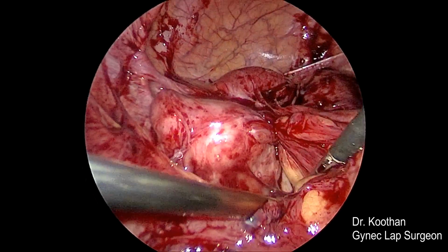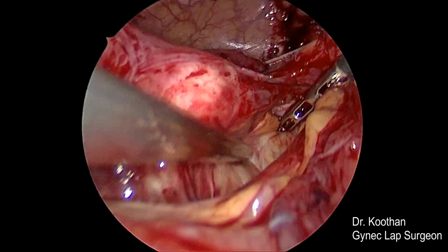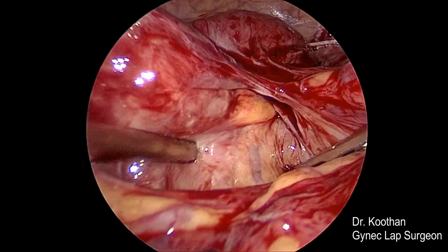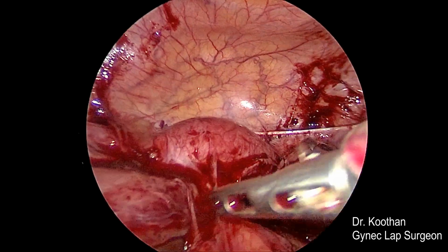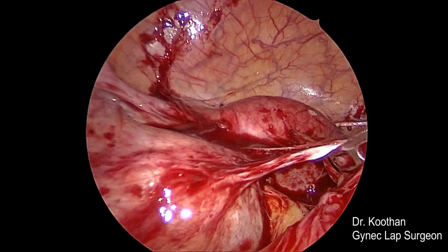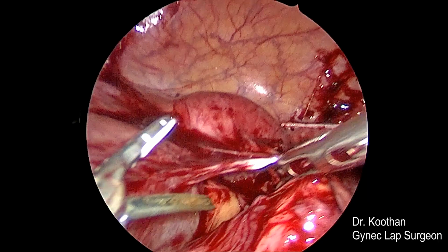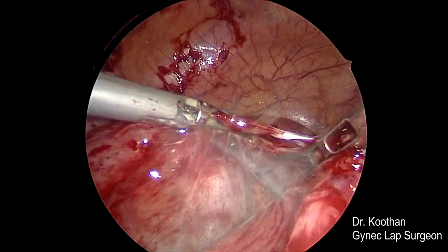So left side, what you can see is the huge Pyosalpinx, and the right side is the mesorectum, which is being dissected. We are using the harmonic to release the adhesions.